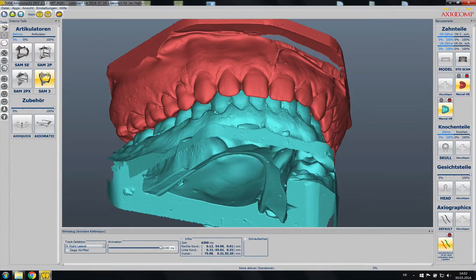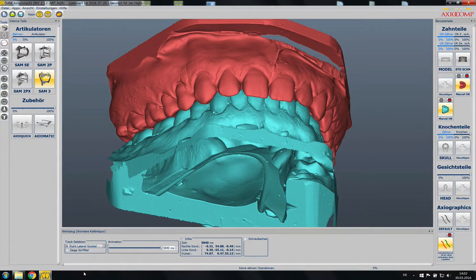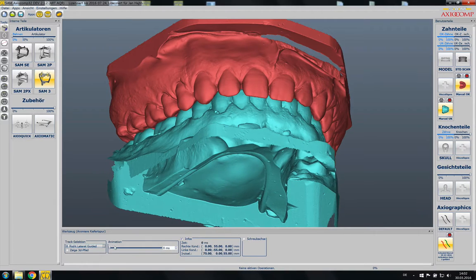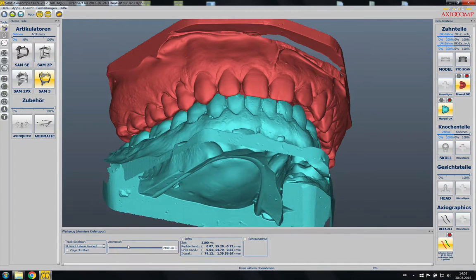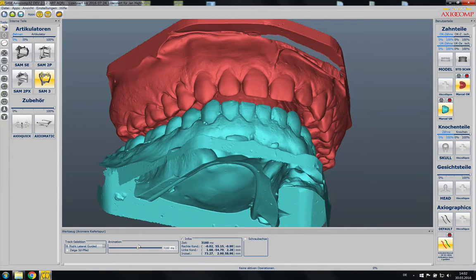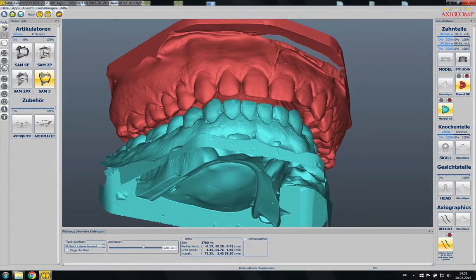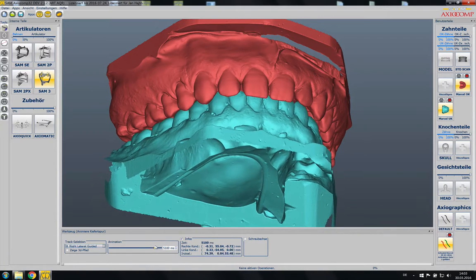In this case I applied some pressure laterally to the jaw to simulate some load, like when the patient at night lies on his pillow and is grinding.